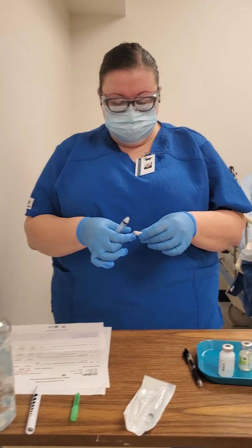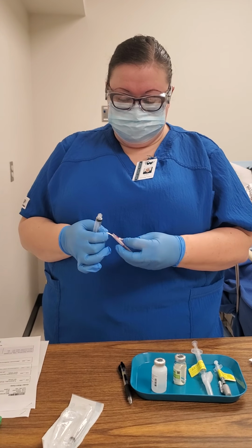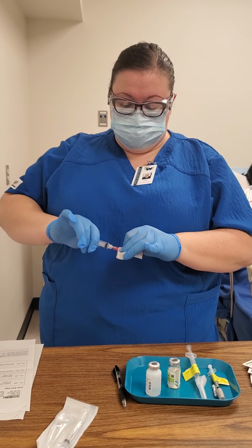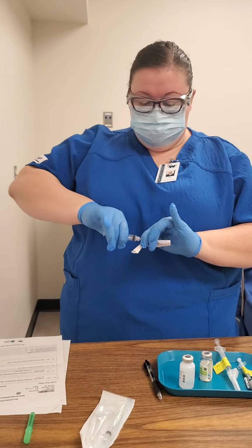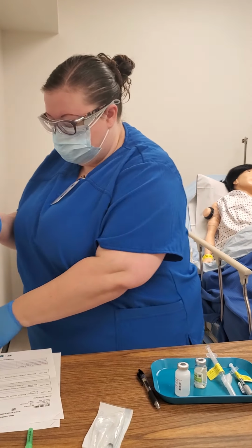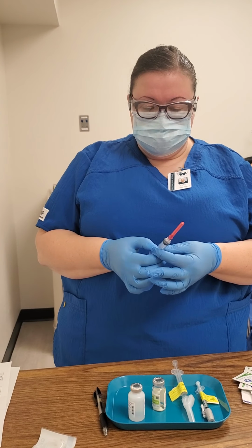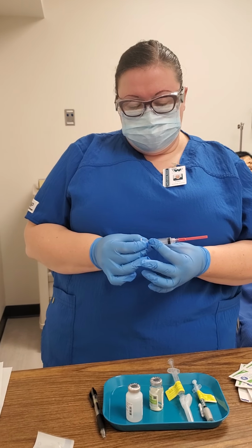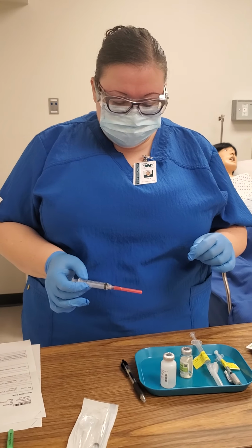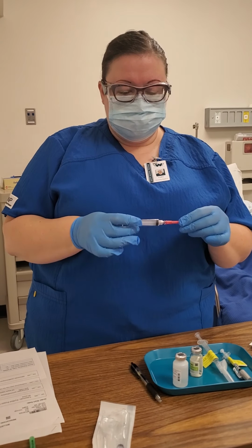Okay. Put my needle on here. And for video purposes, I only have a 5 milliliter syringe here. So I'm going to have to withdraw saline solution twice to reconstitute.